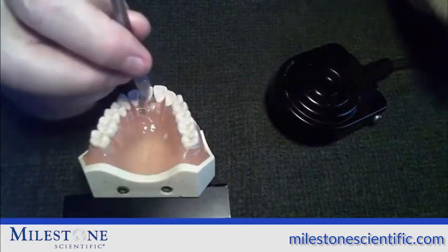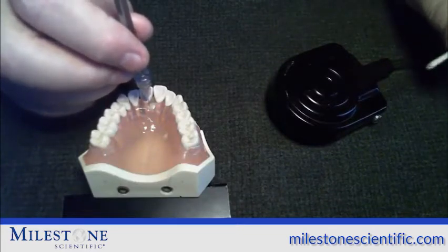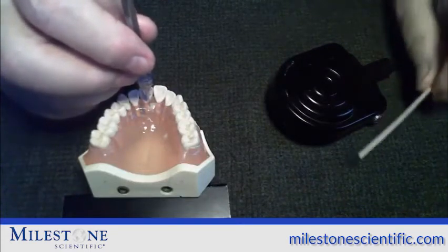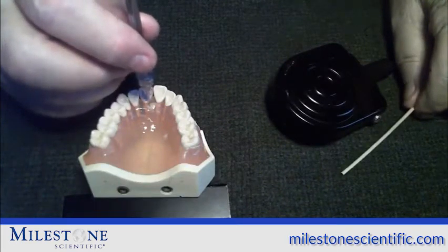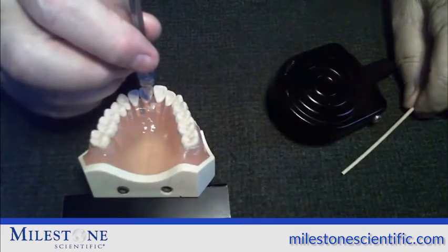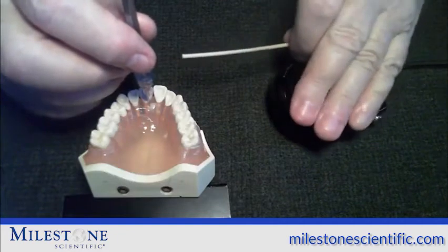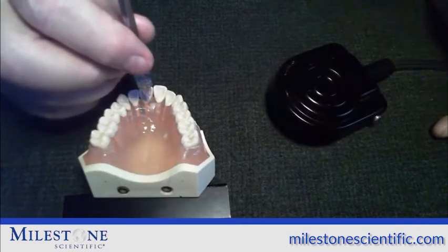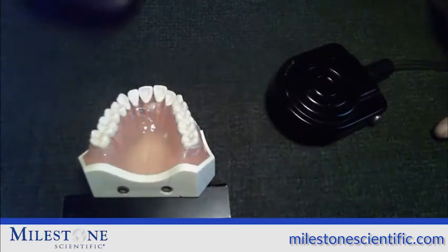The dosage depends on the patient. For an adult patient, normally use three quarters to a full cartridge of lidocaine, or no more than one half cartridge of articaine. For a child patient, use one half of that dosage — so of lidocaine, no more than half a cartridge. If there's still anesthetic in the cartridge, to remove the needle, enter into aspiration again by hitting the foot pedal and releasing. After the third beep of aspiration, take the needle out — beep, beep, beep, out — then put the needle on the patient's bib or on the bracket table.